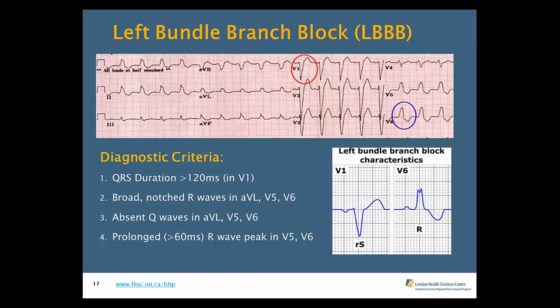So again, it's very good at determining left bundle branch block. If your ECG does indicate a left bundle branch block is occurring yet says STEMI, 99.9% of the time this is going to be an exclusion from the PCI center, and this is going to be transport to the closest hospital.